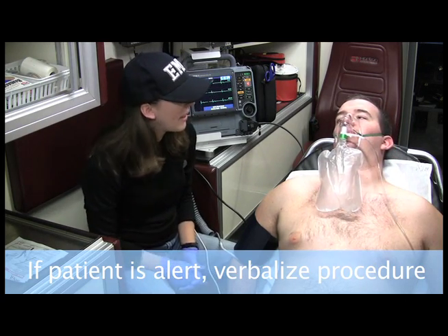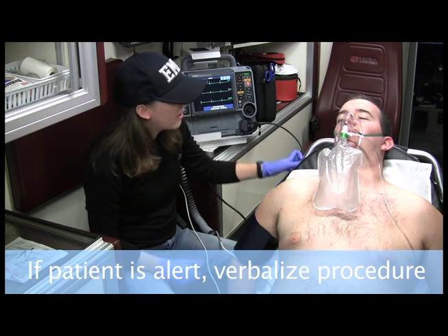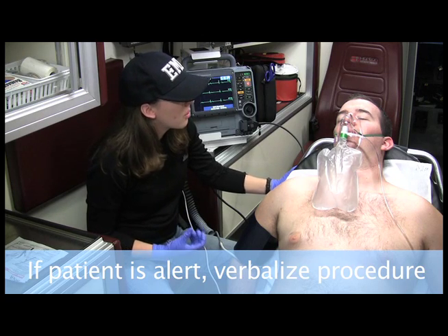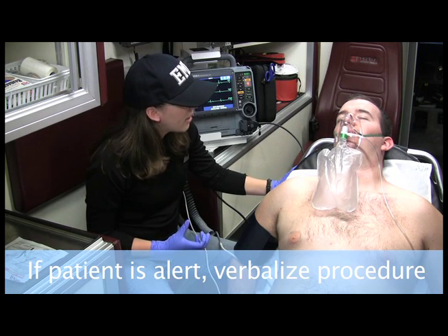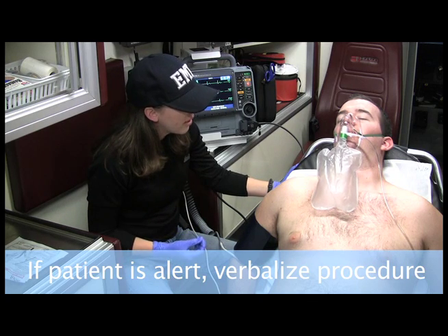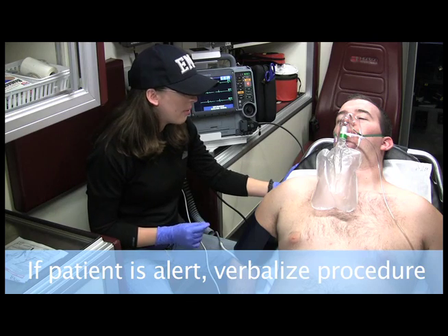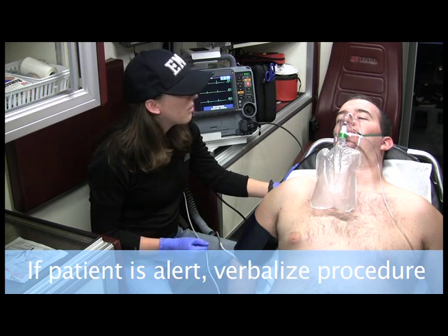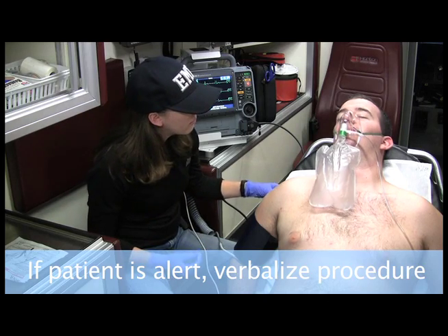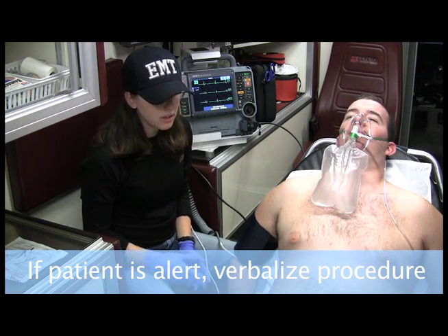Tom, do you know what a pacemaker is? What I would like to do is kind of like what a pacemaker does. Your heart is going a little slower than it should be, and that's why you feel so bad. So what I would like to do is speed up your heart rate. Now, it's going to be a little uncomfortable, but hopefully we can get some pain medications to you and it won't be such a discomfort. Are you okay with that? So I have permission from the patient to continue.